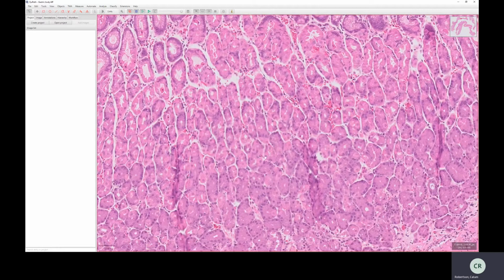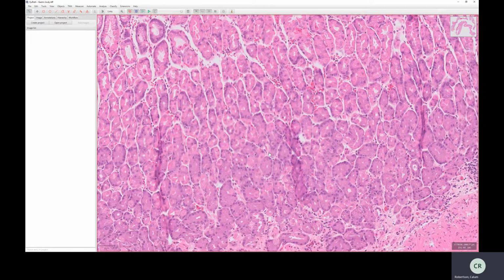But in between these gastric parietal cells, we've got a different type of cell, like here, where the nuclei are along the bottom, and their cytoplasm is all towards the luminal aspect. They don't have that central nucleus that gives the fried egg appearance. Here's some more around here. Also their cytoplasm is a bit bluer. I'm not sure how well that comes across in the video, but contrasted to the bright pink parietal cell cytoplasm, these are a wee bit bluer, and also a bit granular.